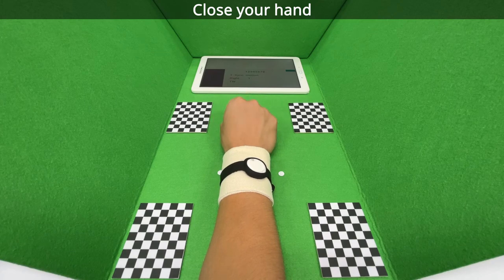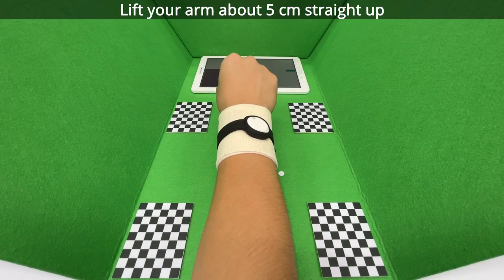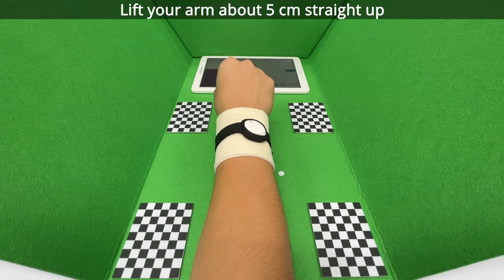Close your hand. Lift your arm about 5 cm straight up.